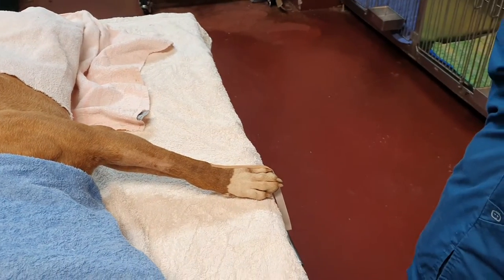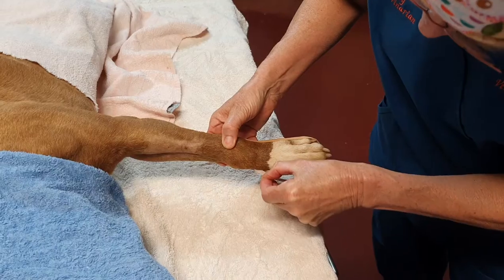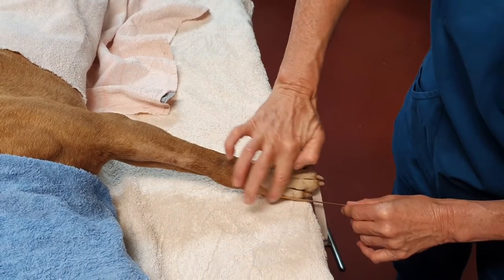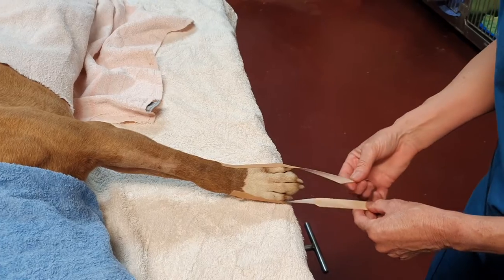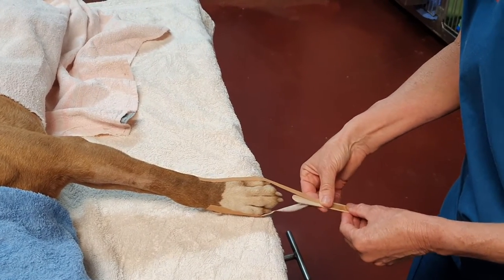So let's put on a lateral stirrup and we'll place a medial stirrup. You can use longer stirrups if you like. Make sure they do stick well. I'm using a tongue depressor here just to keep the stirrups apart. You can use anything that just doesn't stick — a wrapper of some bandaging material if you like.